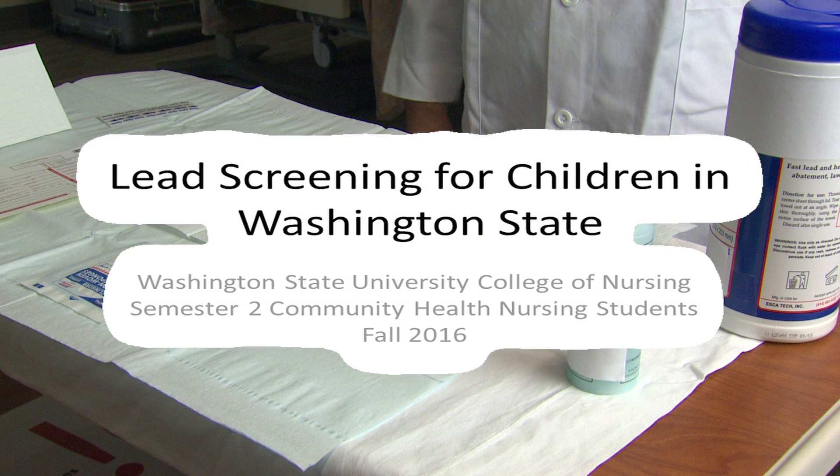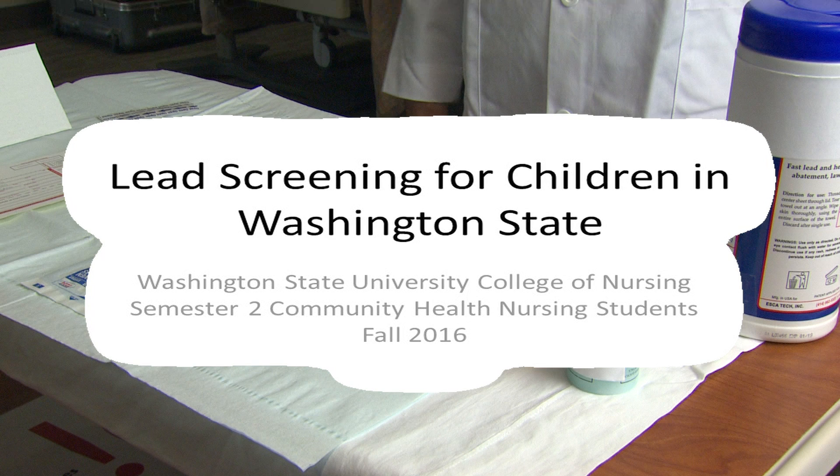In this video, we will be demonstrating how to use a waterless filter paper blood lead test kit.